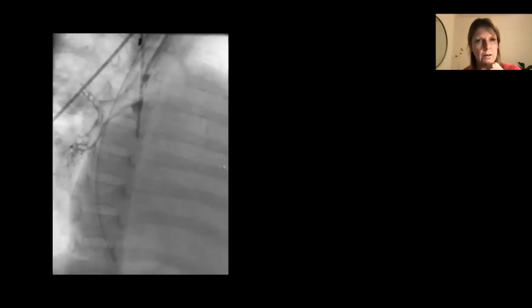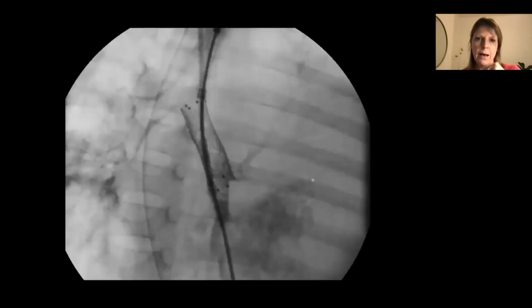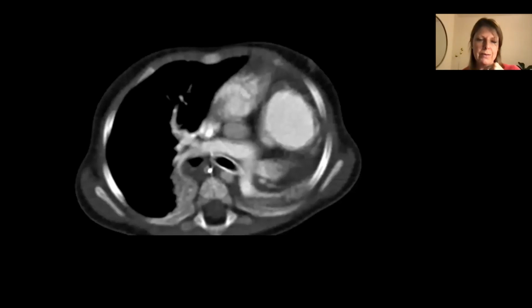So we thought quite hard about this. The trachea is at the top of this image. You can see contrast filling really nicely the right main bronchus and its segmental bronchi, but no contrast into the left lung. With a bit of effort, we've got a guide wire to cross that compressed left main bronchus, and we've placed a metal stent across it. We didn't know if that would work. You can see it there on the CT. We thought maybe the pulsating heart might collapse that metal stent, but it didn't.